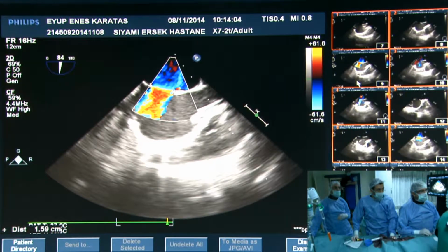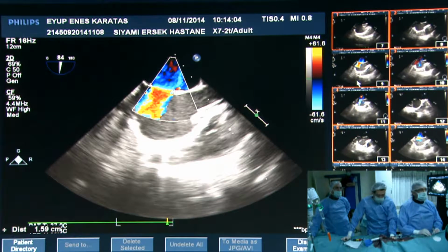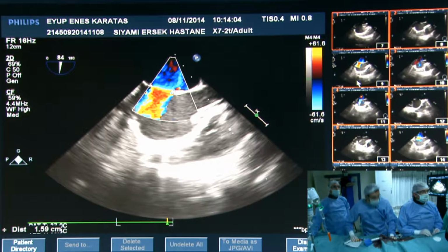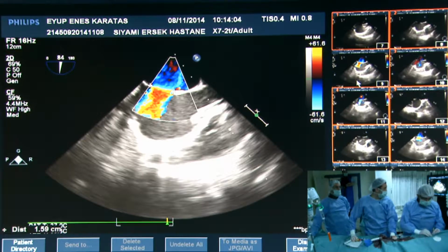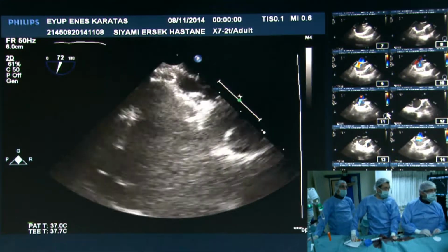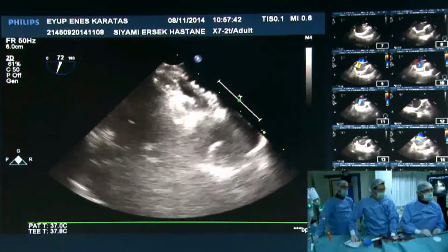Yeah. So I do not do balloon sizing. Well, disregard Shaq's opinion. Yeah, that's the routine basis, do balloon sizing. Why don't you do balloon sizing, Shaq? Never. In some cases, why? No, only a limited number of cases where the septum is very floppy, and I'm not sure whether we would get a clear size answer. Here, this is a fairly rigid septum, and you've got good information about the size of the defect on 2D as well as color. Then I would not consider balloon sizing. Yeah, but to some extent, the floppiness of the septum is rather subjective, isn't it?